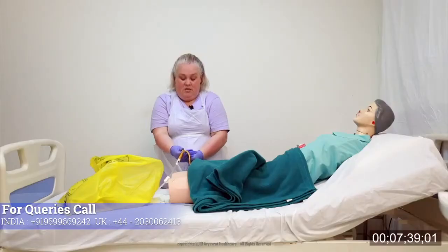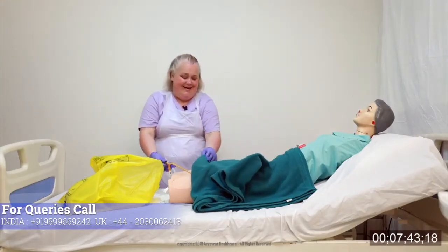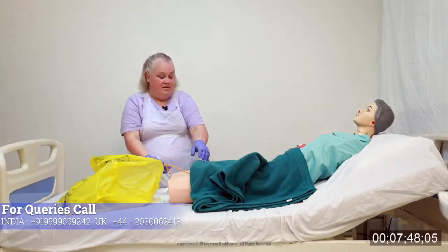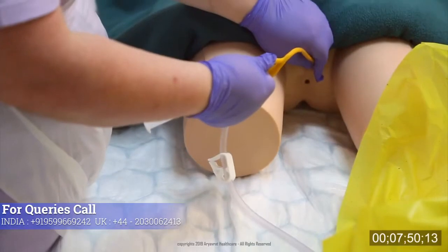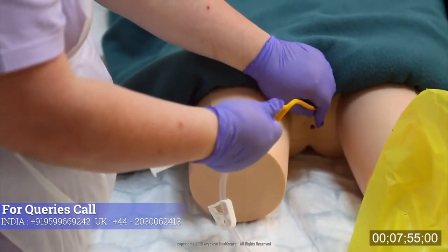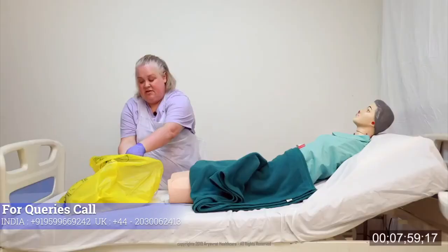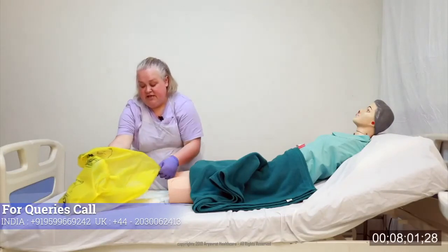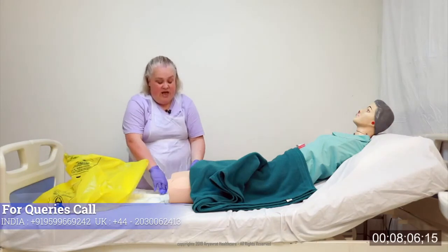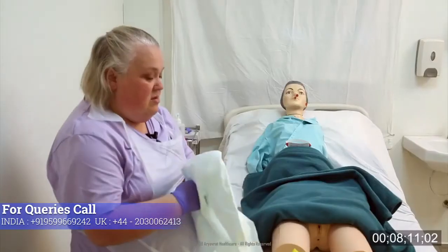Okay, so I'm ready to remove this, Helen. What I would like you to do is take a deep breath in, okay, and when I say, I'd like you to cough and release, okay? Ready? Yeah. And go. Cough, cough, cough. All done. Out. Putting that straight into the clinical waste. And Helen, I'm just going to pull this out from underneath you. Okay, well done. Thank you.